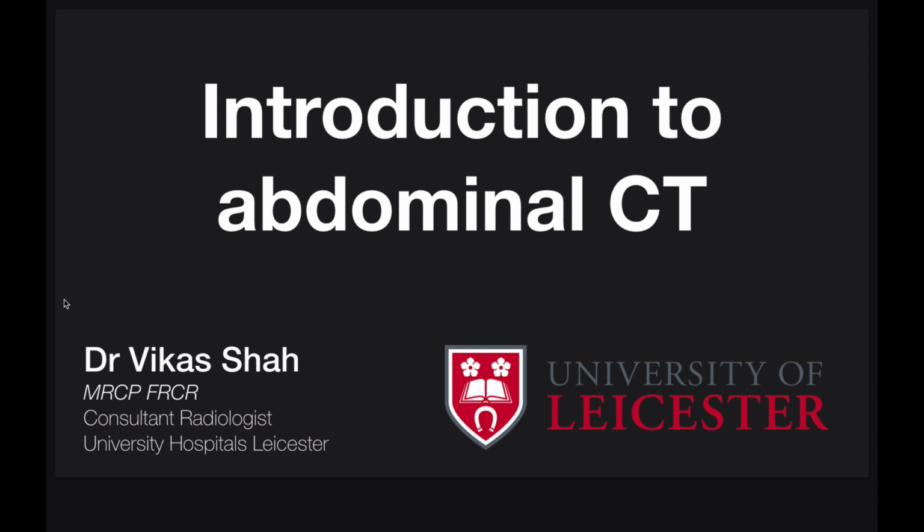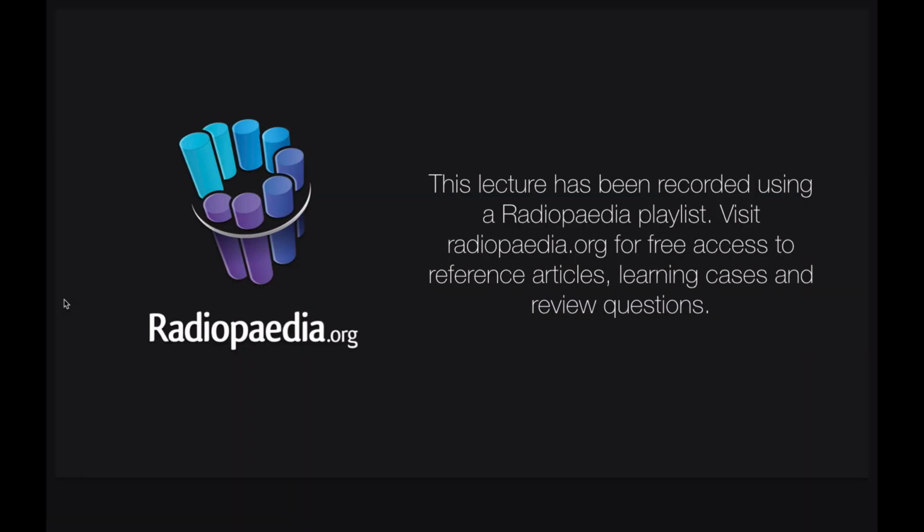I'm a consultant radiologist in Leicester, and this talk is Introduction to Abdominal CT. I've prepared this talk using a playlist from Radiopedia, and you'll also have received some links to further reading on the Radiopedia website, where there is a whole heap of freely accessible material, including articles, learning cases, and some review questions as well.